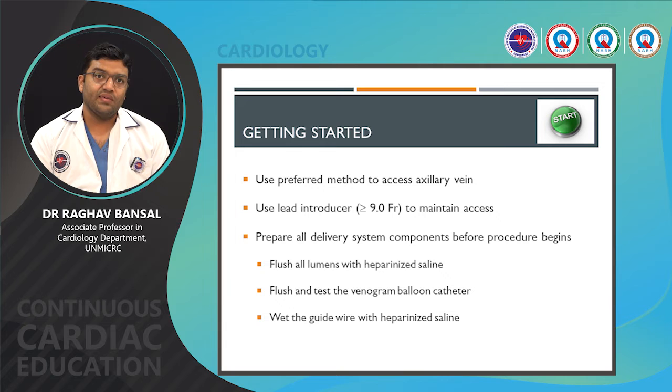And all the guide wires which we are going to put inside, we should first wet the wires with the heparinized saline so that there is no clot sticking here and there.